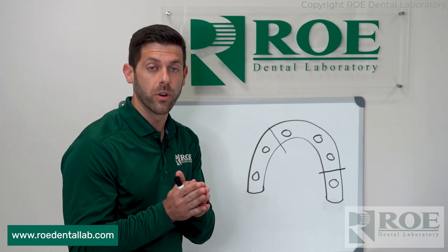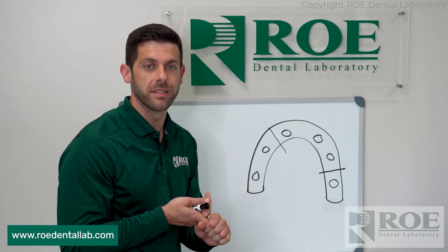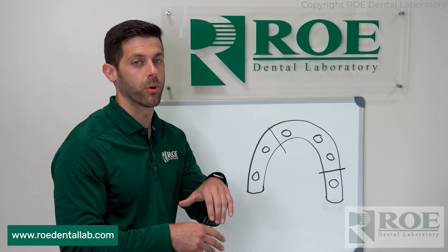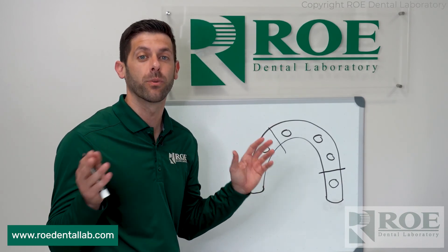From there we're going to fabricate a new printed try-in for you. Once you get that, you're going to want to dial in the bite, take a reline impression, make sure everything fits perfectly, and then we transition to final. But the most important thing is passivity, so — one screw test, Sheffield test — do it every time.